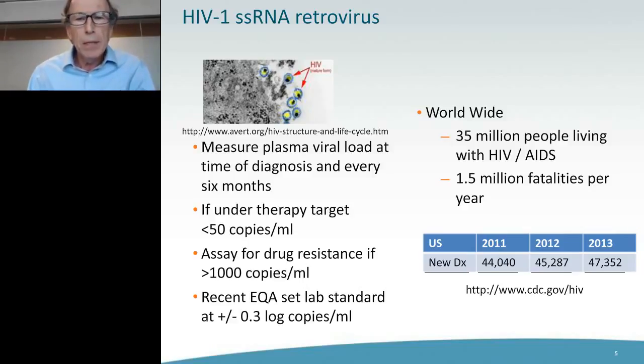And typically in the US, there's another retest of viral load every 6 months. So fairly frequent test frequency for HIV, as well as under therapy. Now under therapy, you can often see the viral loads dropping to less than 50 copies per mL.